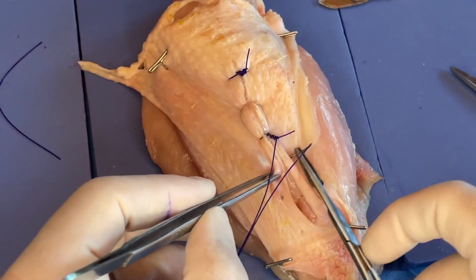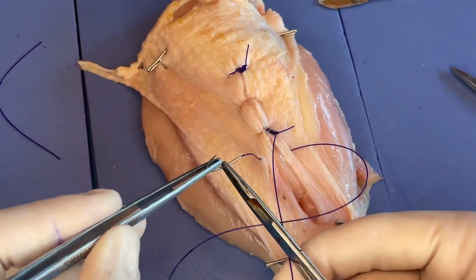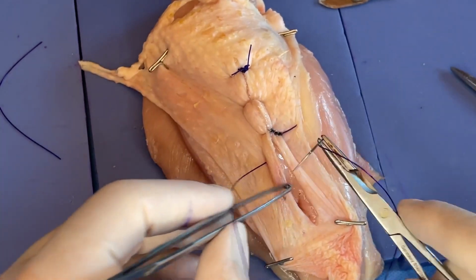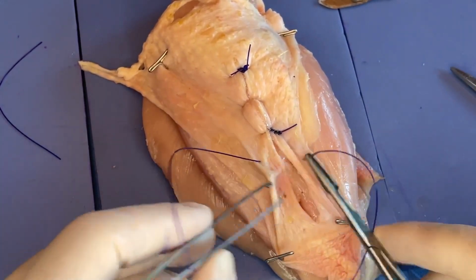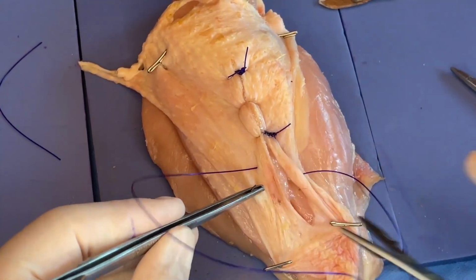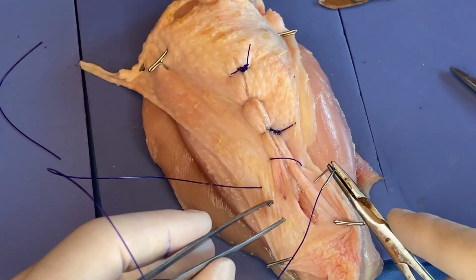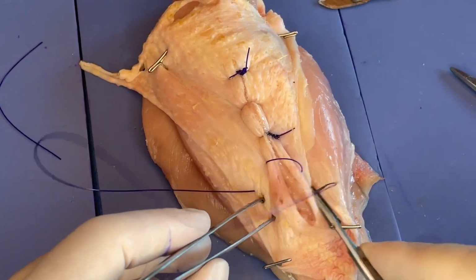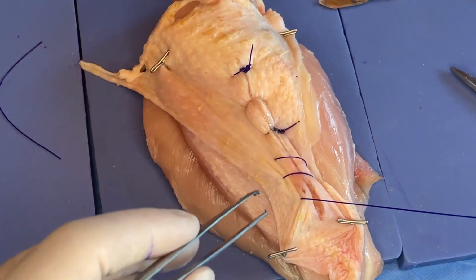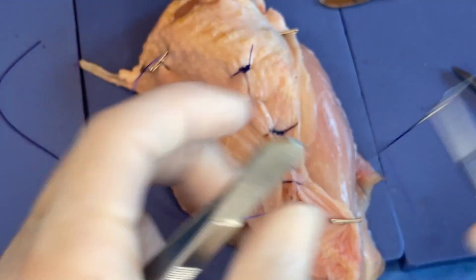So here, and you can see that when we go to pull through this first pass, that it does kind of pull the knot and it kind of tucks it under the tissue a little bit. So we'll do another pass there, and another. So nice running.